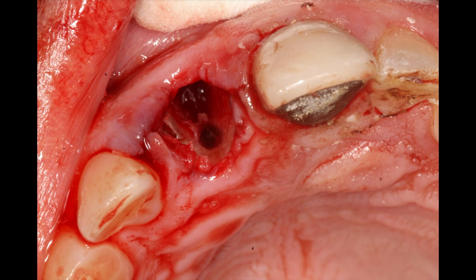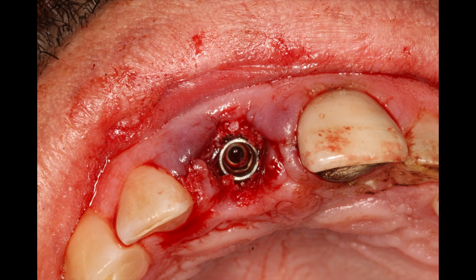So you can see I've placed the osteotomy to the palatal in the extraction site, which is what you're always going to do because you want to come out the cingulum. And now what I'm going to do is I place graft material all around here, and then I recreate the osteotomy with a Versaburr, a slow dry and reverse, and then I place the implant into the osteotomy with the graft already in. That way I get a more homogeneous condensation and dispersement of the graft material. So that's what it looks like when you do it.